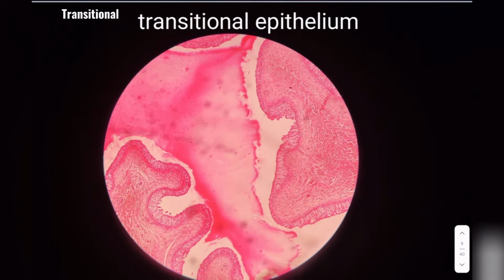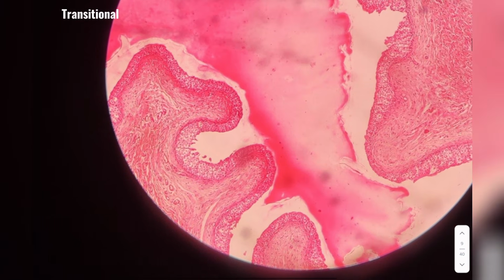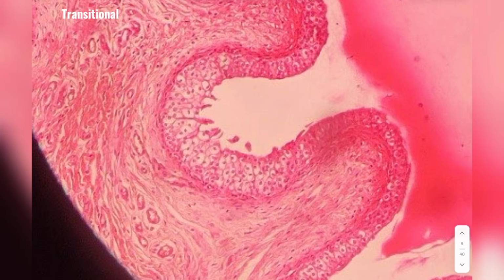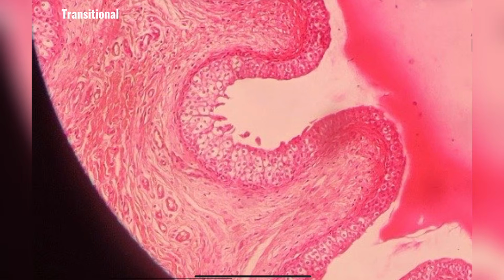Next up. So this one is a lot unique and easy to identify due to the shape of the cells. You can see that the bottom cells are round, right? So at the bottom you have round cell.